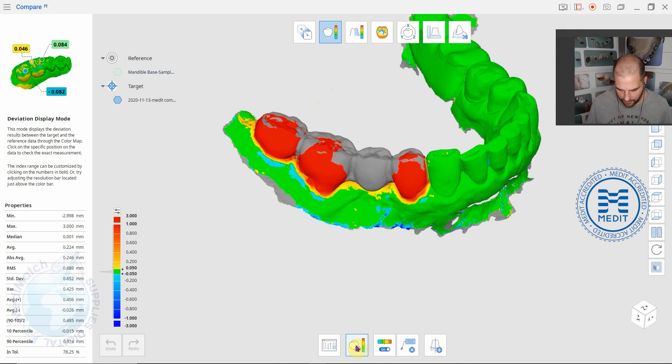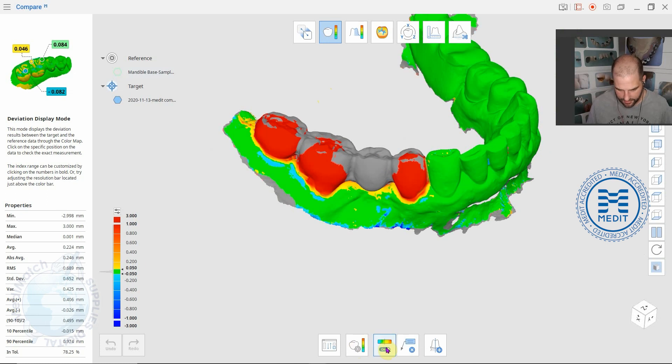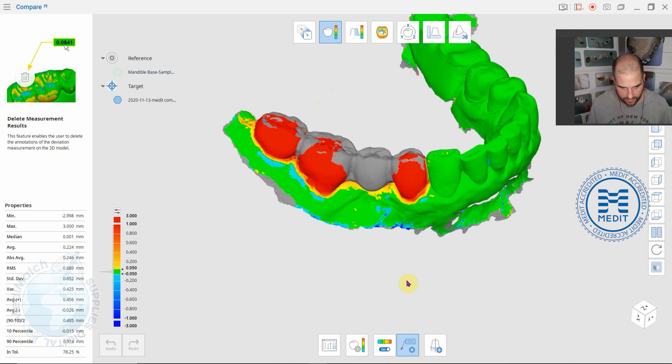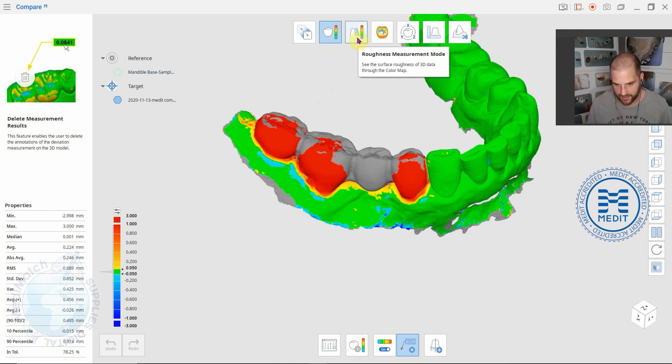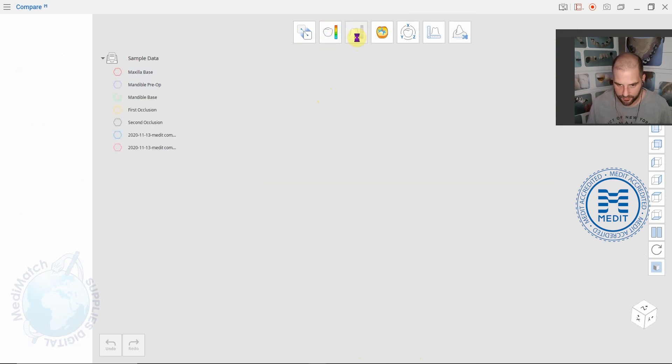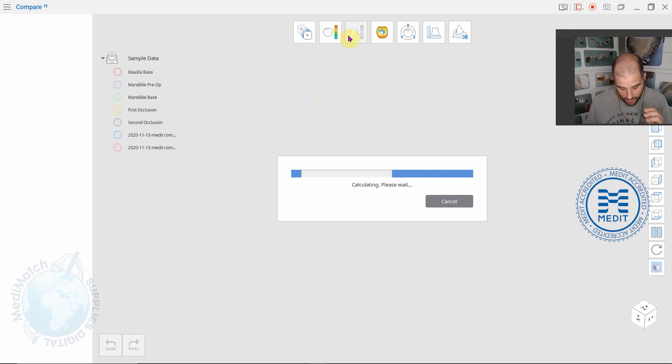You can play around with the scales down here and whether you have the color map on, and you can write some annotations if you want to as well.